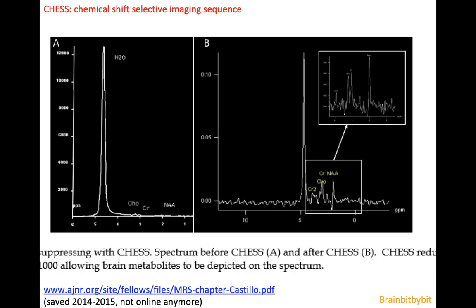Most protons are located in water and in fat, and because the brain has a lot of water but no macroscopic fat, you only have to suppress the water peak in the brain — which also makes it a very good tissue for spectroscopy. After suppressing the water, you can rescale the y-axis and see the other metabolites that occur in much lower concentrations.